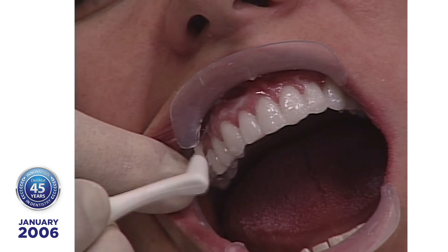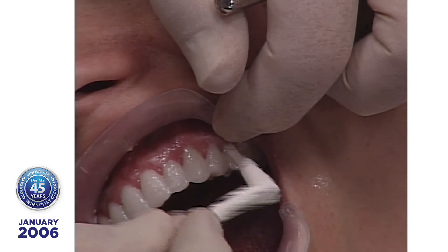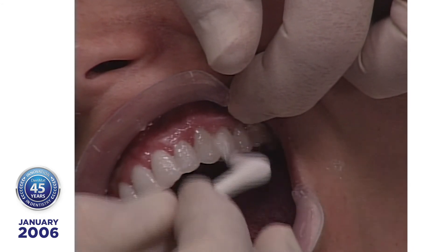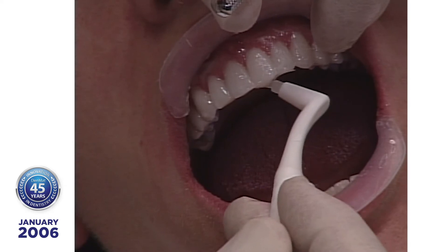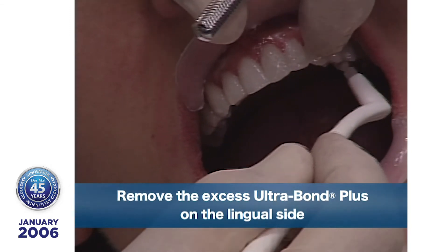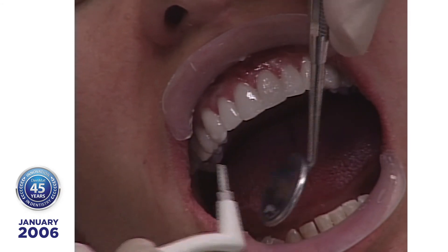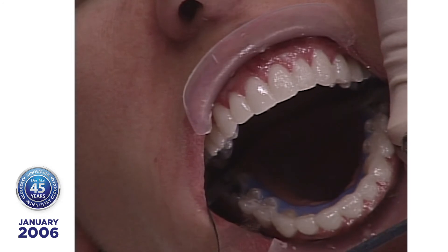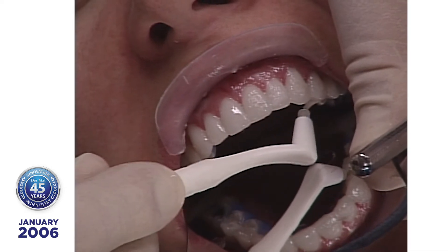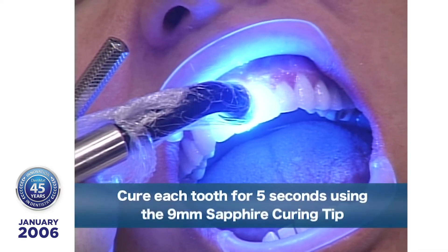Now we're taking the excess off. With the ultra bond being light-cured, it has a kicker in it — it will cure in about 10 or 20 minutes. I'm wiping off the excess on the lingual. And even if I don't get the light to it, the tenure S is setting some of the ultra bond. I've removed most of the excess. Now we're going to take and apply a five-second cure to each tooth.